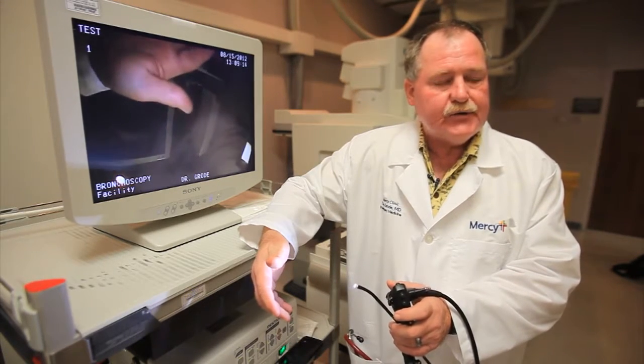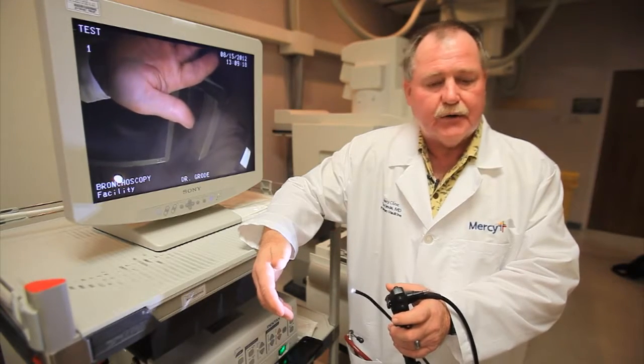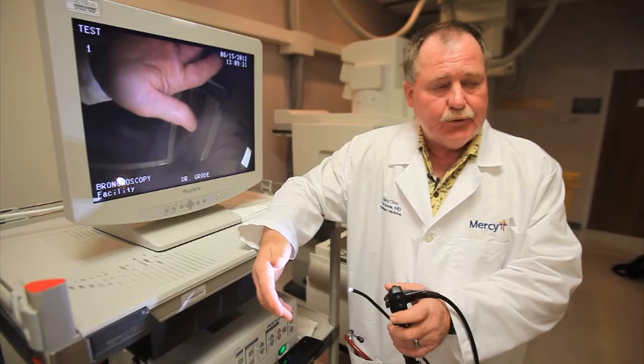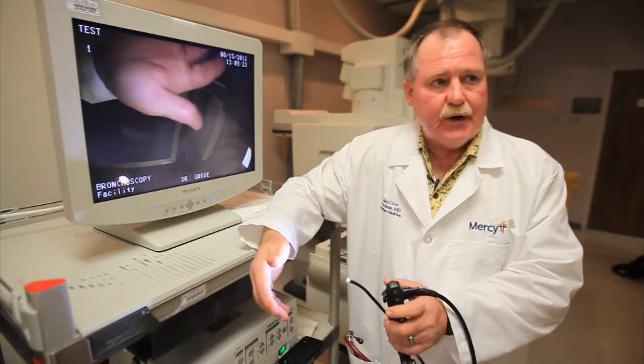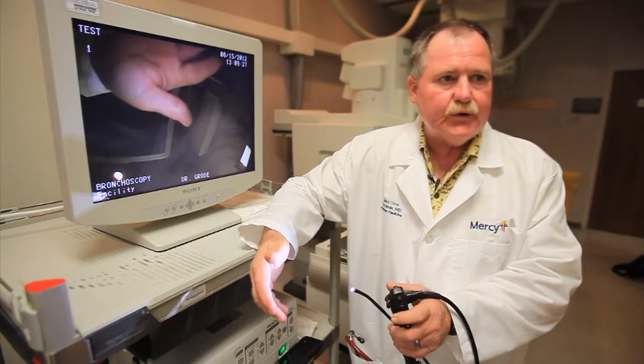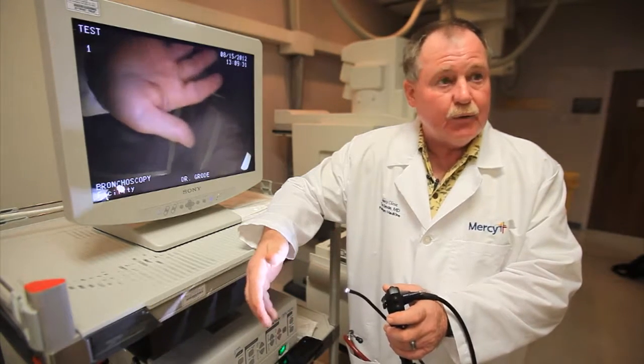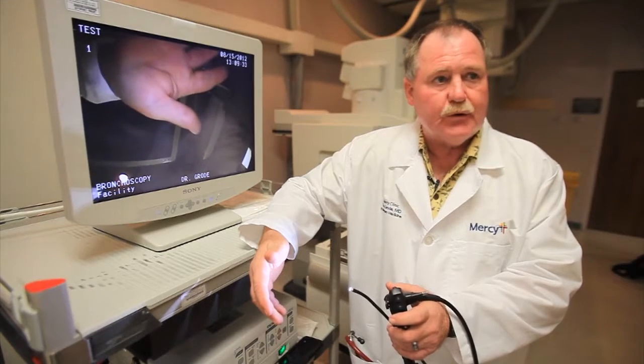We go down and examine the upper airway first, the vocal cords and the area alongside, and then pass through the vocal cords into the main airways. We can see about one-third of the major airways distance-wise, and then the airways become too small for the scope to go any further.